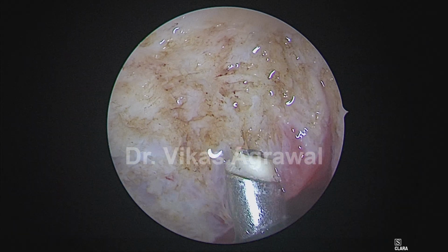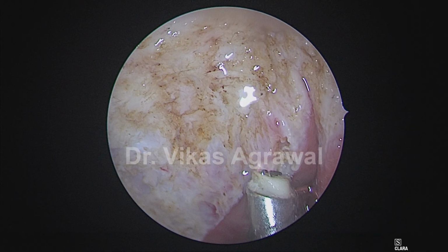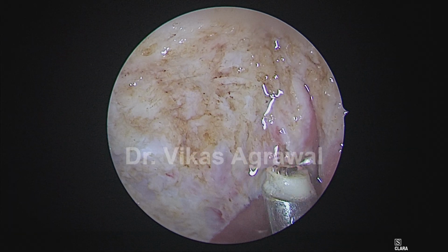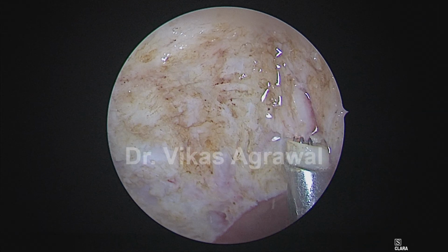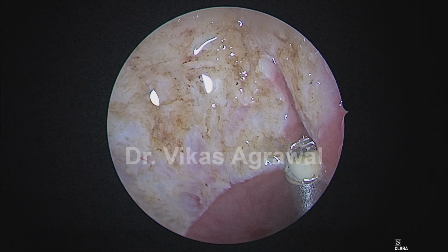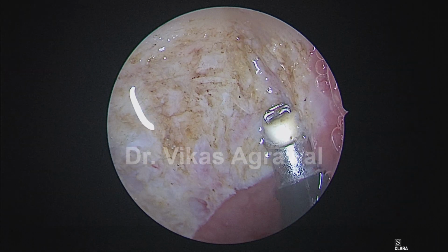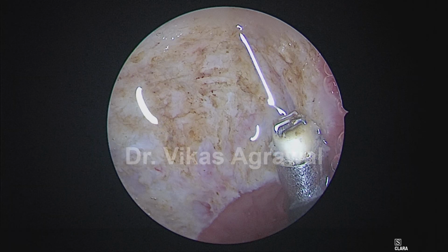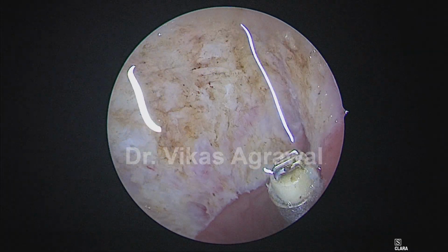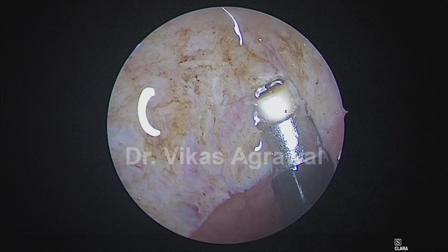So now the last bit, and this is the Passavant's ridge area. You can see the horizontal contractions of the muscles. Be careful. This area you can get an aberrant carotid. So best is to direct your wand medially. I'm going behind the torus tuberous.